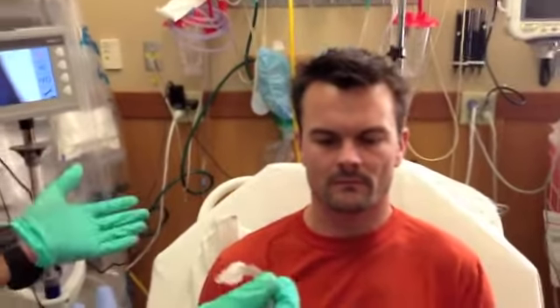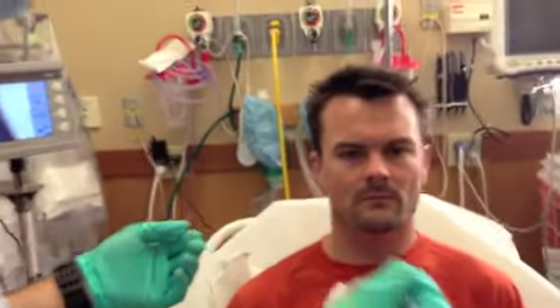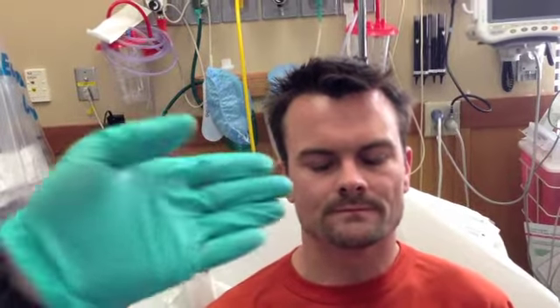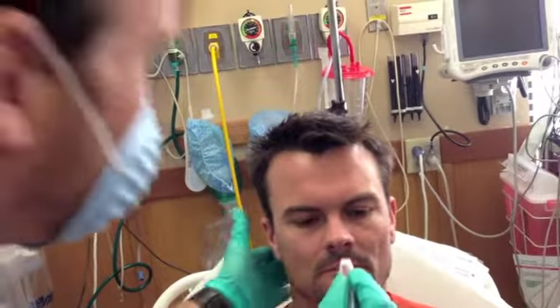I'm inserting a 6-0 endotracheal tube. This is the absolute smallest tube that will work with this device. I put a little bit of the 5% lidocaine jelly on it to provide some lubrication and anesthesia. I'm just going to insert it like I would a rhino rocket, directly anterior to posterior.